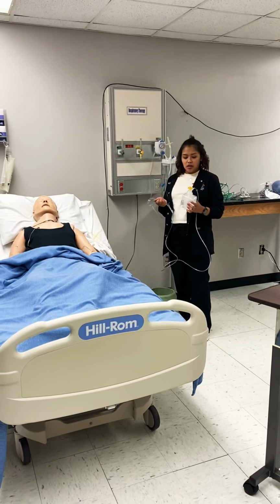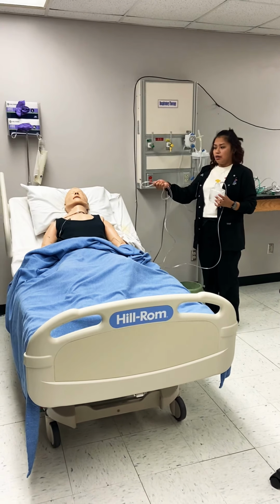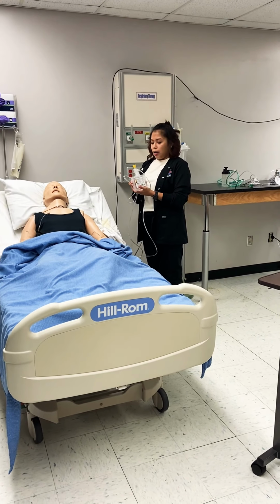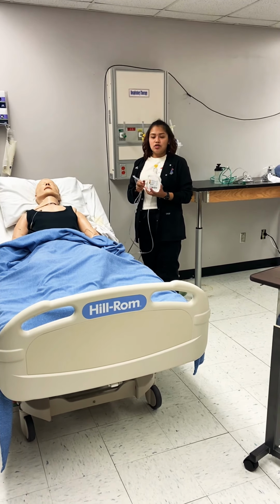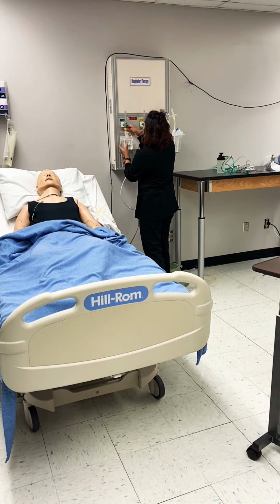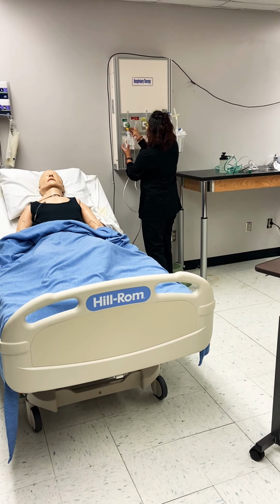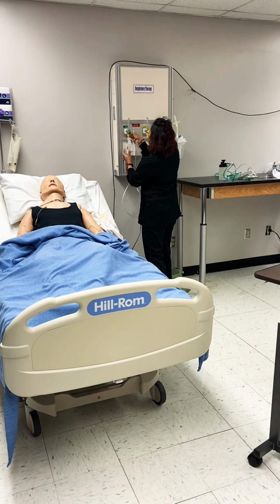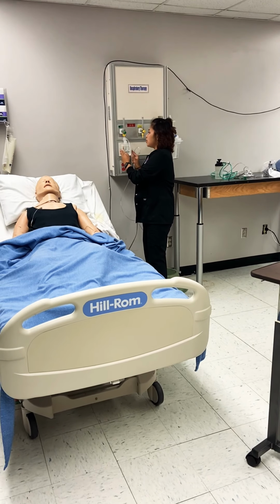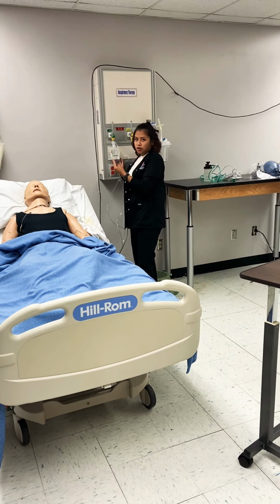Today I'm going to explain the low flow devices and then how to connect it, put a patient on the devices. So first I'm going to start with the nasal cannula. The nasal cannula, you usually connect it on here because it already has the Christmas tree. And the flow that you set it on, or you can set it on, is 1 to 5 liters. And you sometimes use a bubbler, but you want to use a bubbler if it's greater than 4 liters.